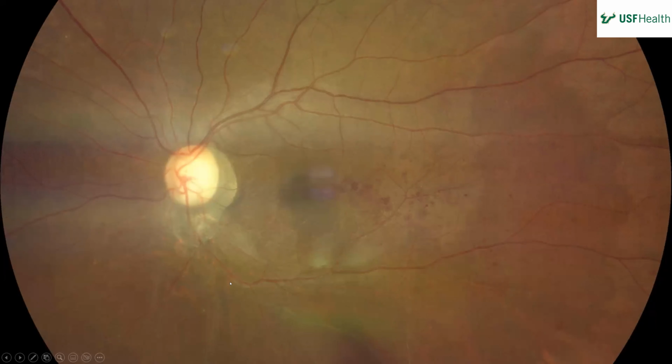Dark without pressure, don't they call that? Have you heard that one? No, I haven't heard that. It could be white without pressure. Dark without pressure, where instead of being white, it's in the same area, but it's just darker. Oh, yeah. Okay. All right, keep going. Thanks.